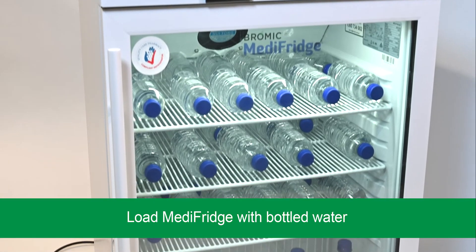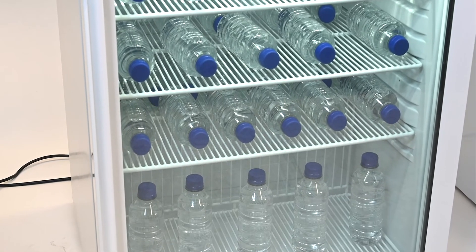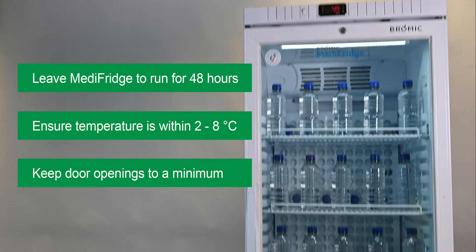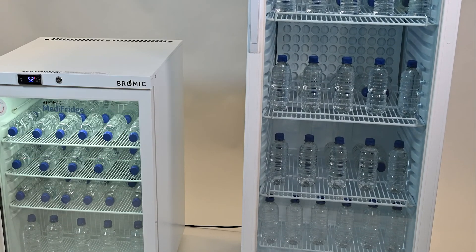Leave the fridge to run until the safe operating temperature range is reached. It is also recommended to monitor your Medi-Fridge for a minimum of 48 hours before storing sensitive stock to ensure temperatures are maintained between 2 and 8 degrees Celsius. During this time it is best to keep door openings to a minimum.